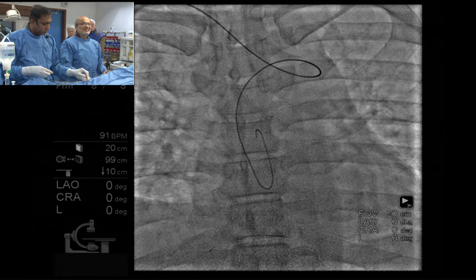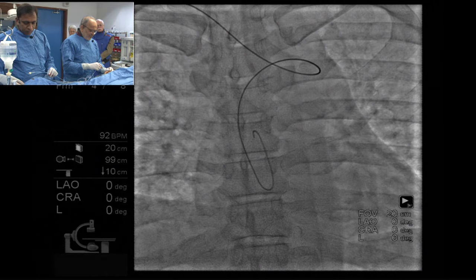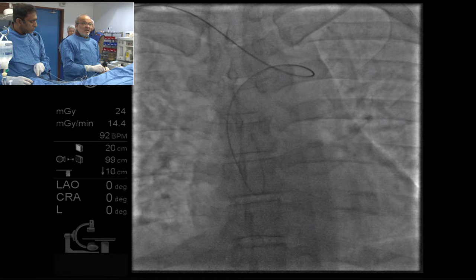He is a 45-year-old gentleman who had his stent done 6 months ago, and he has been referred to us for in-stent treatment. We have done an angiogram and prepared him for TRI.